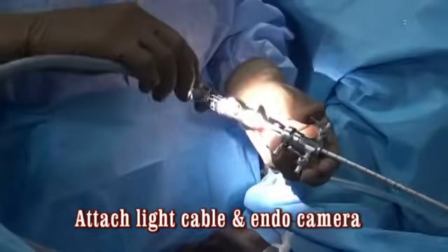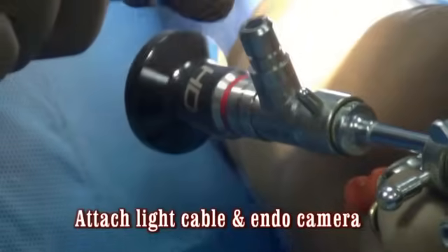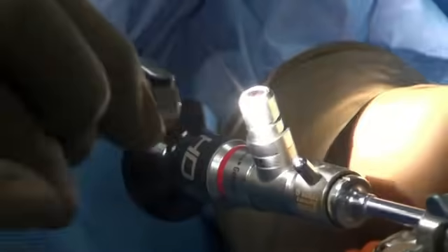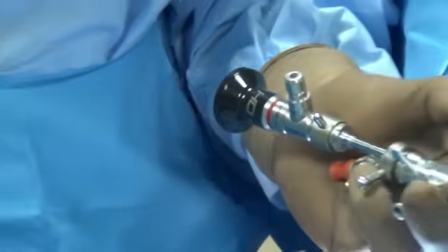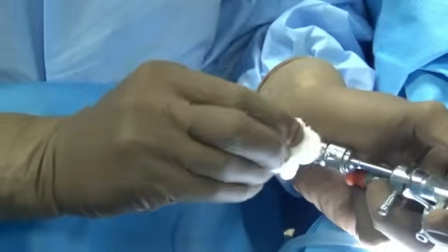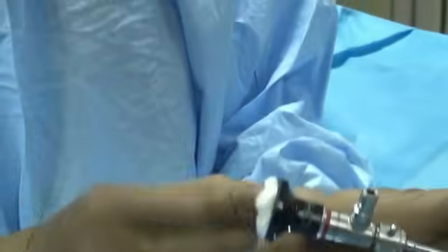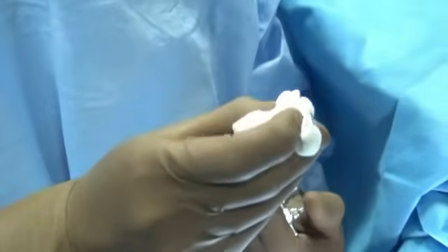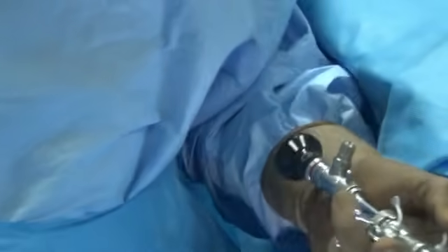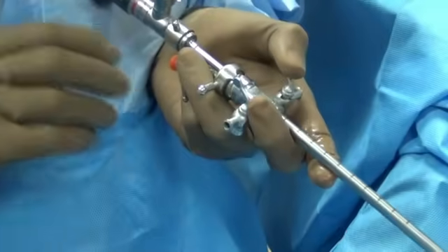Having done that, connect the light source at this point. Before connecting the light source, examine if there is any dirt at the connection point — if there is, clean it with a gauze piece. Make sure there is no dirt or stain in this area; clean it well. Also examine the eyepiece and clean it well. The tip should also be clean — no stain or dirt — then attach the light source.